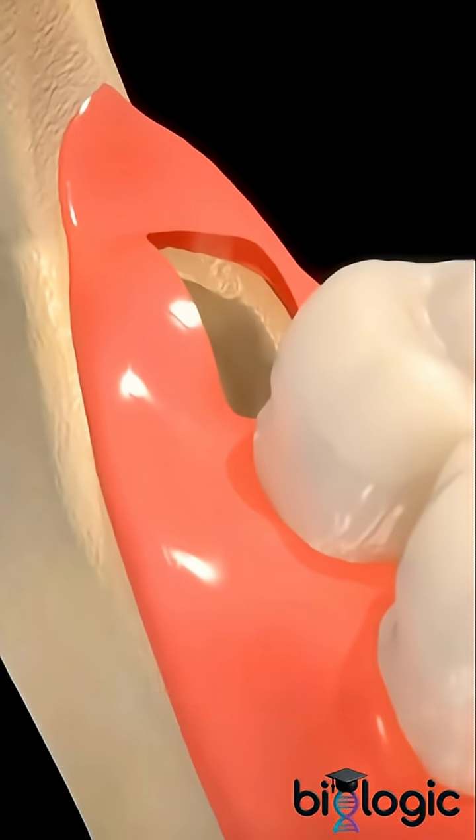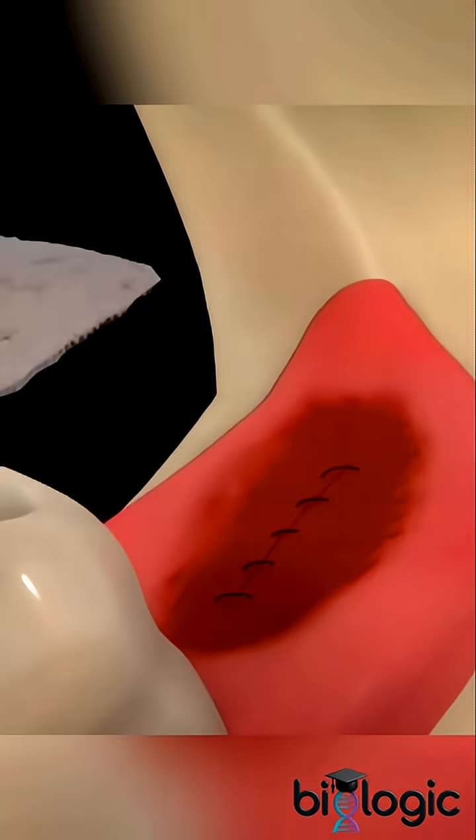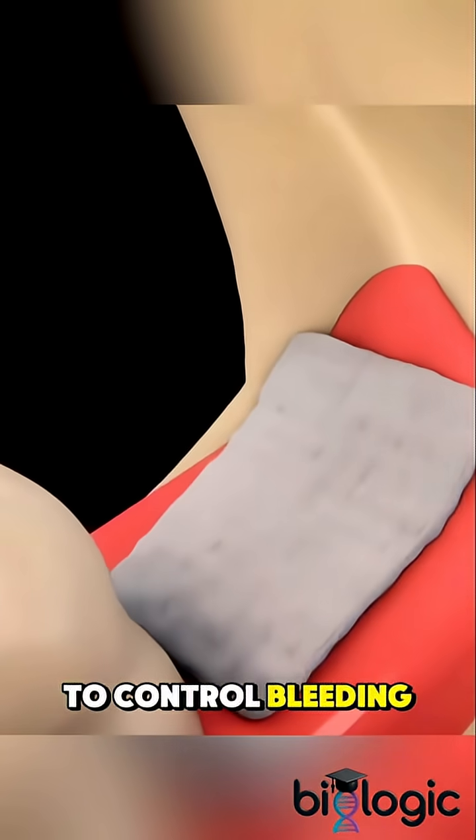After removal, the area is cleaned, and stitches may be placed to help the gum heal. Gauze is applied to control bleeding.